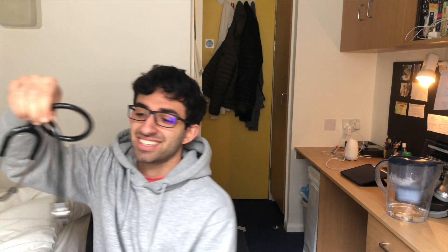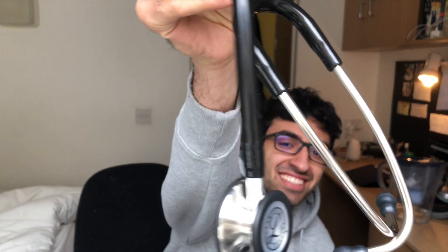Alright, there we are. That's the stethoscope. I don't know if you can see it — I'm bringing it close to the camera — but it says my name: Siobhan Pan. I got it engraved. This is so cool, oh my god.